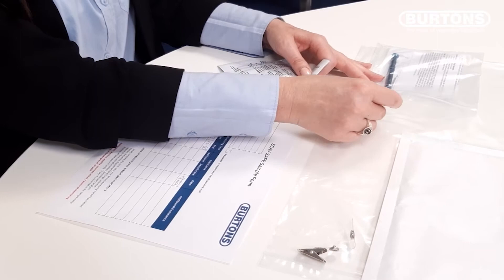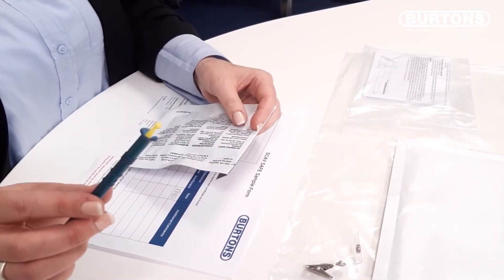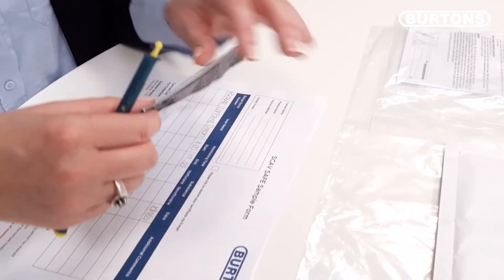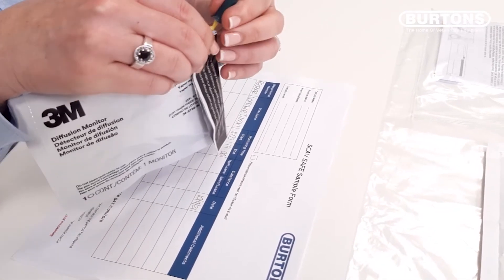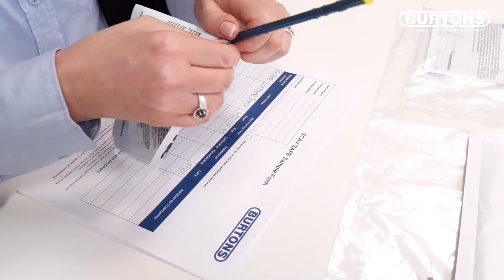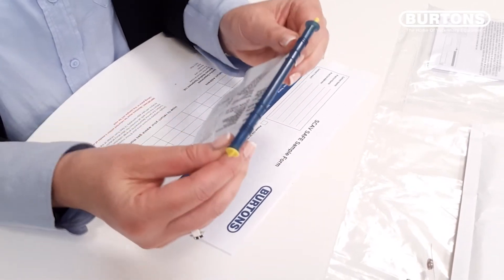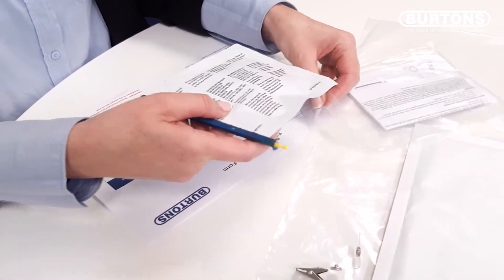Using the pouch sealing stick, place the yellow tab under the crease of the fold with the slitted side facing down. Slide this along the top of the pouch to seal. Place this back in the plastic bag.